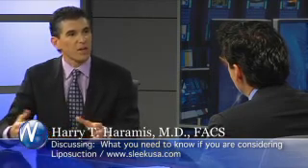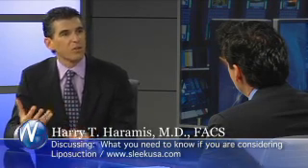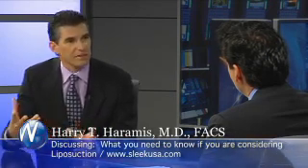The regular liposuction was kind of thrusting the cannula in and grabbing clumps of fat, traumatic to the tissue, causing bleeding, discomfort. This way the fat's ground up, it's morsellized, it's softened, it's melted. It doesn't traumatize the nerves or the blood vessels or anything. It's easier to take the fat out. There's less trauma. There's less blood, hardly any blood. So the patient has very little bruising, very little area to heal. They kind of get a jump start on the healing process.